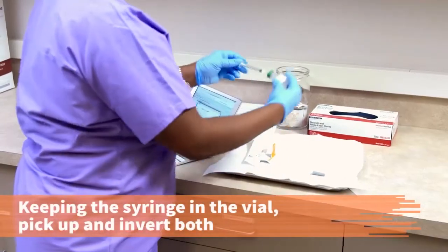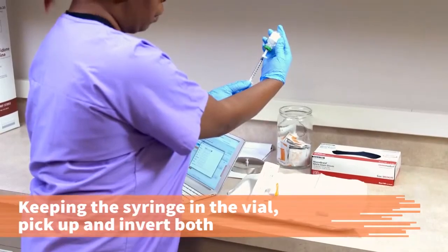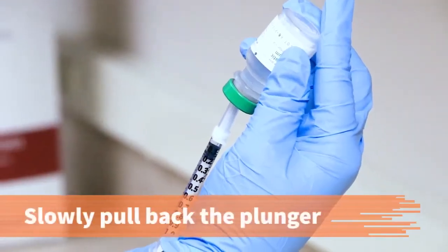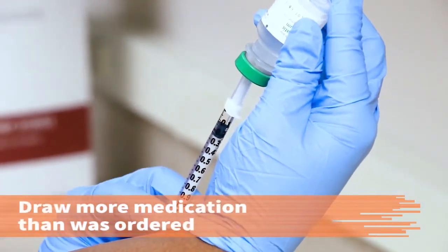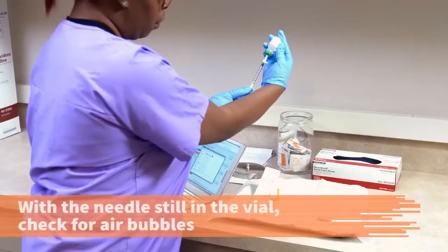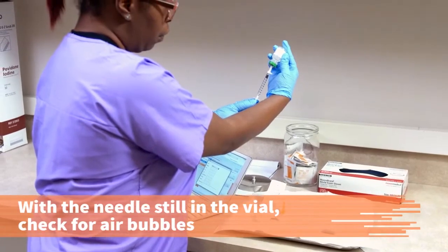Keeping the syringe unit in the vial, pick up and invert them. Slowly pull back on the plunger with the unit at eye level and draw up more medication than ordered into the syringe unit. While the needle is still in the vial, check for air bubbles in the syringe.